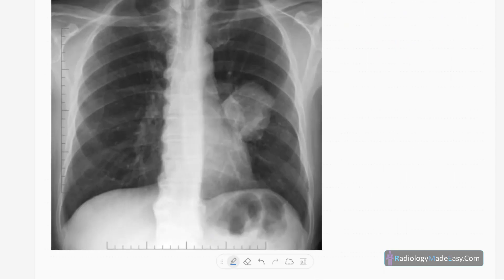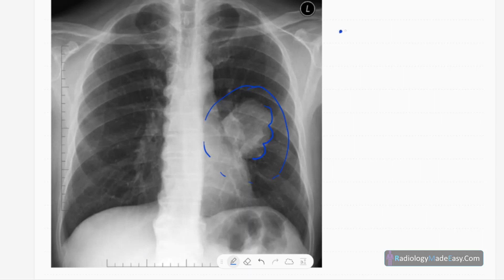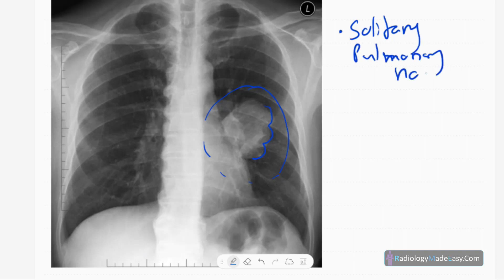This is the frontal chest radiograph of this patient. You can see a well-defined rounded opacity with a lobulated outline projected over the left mid zone. The medial border is obscured due to the heart border, but the other margins are clearly seen. This is a solitary pulmonary nodule.